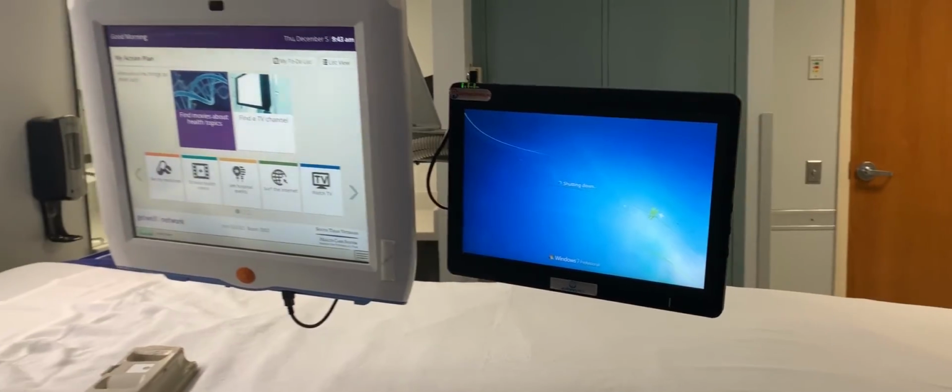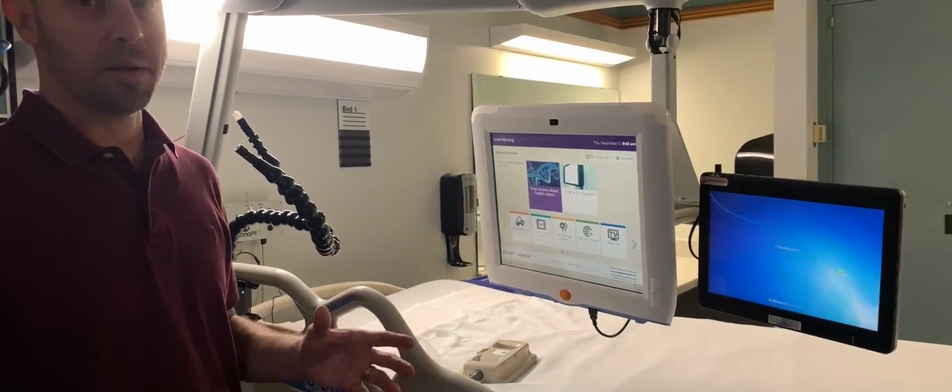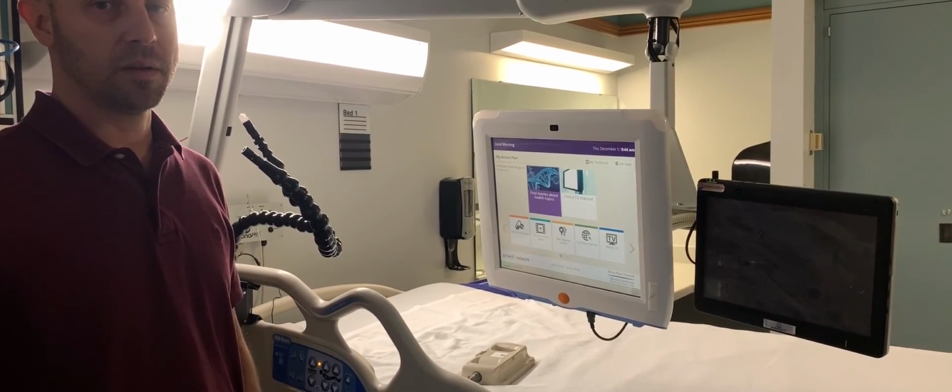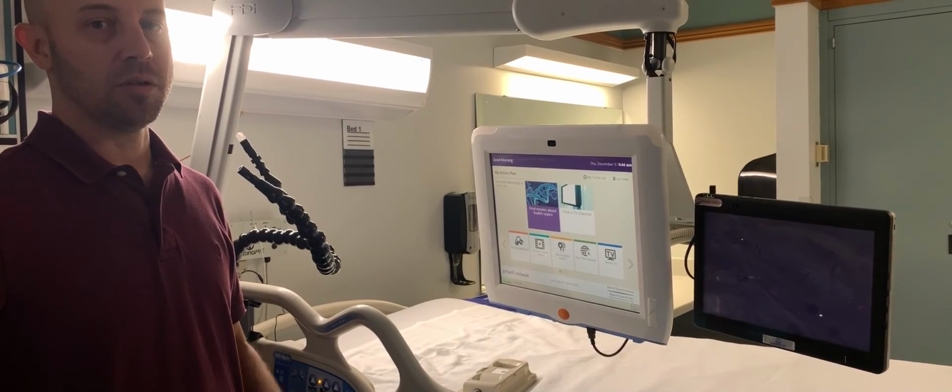After the computer reboots, you can have the patient try the same buttons that he was having problems with before. This should improve the accuracy of the patient using voice control.